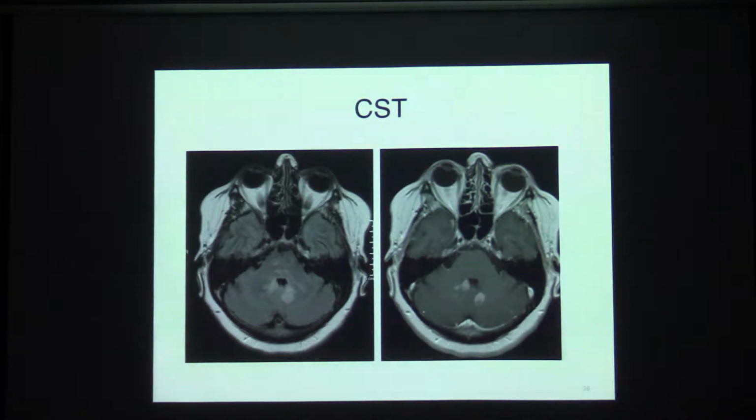We were doing brain tumor conference, and they thought the person had metastatic disease from some other source. And then I was kind of like, well, looking at the images, I said, you've got this abnormality in the corticospinal tract, so this must be the same thing. And so they biopsied it, and sure enough, it was that glioma.